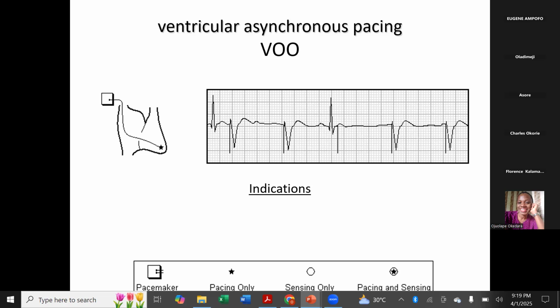So I said, number 1, the first thing is that you can only see one pacemaker spike, right? So that tells you that most likely you're only pacing one chamber, because you can only see one pacemaker spike, which is close to the QRS, right? It's generating the QRS potential. We didn't see any in front of the P wave, right? As long as you are not seeing a pacemaker spike in front of the P wave, maybe the patient does not have a lead in the atrium. The pacemaker spike you can only see is generating ventricular activity. When it paces, you see it generate ventricular activity. So that tells you that it's pacing the ventricle.